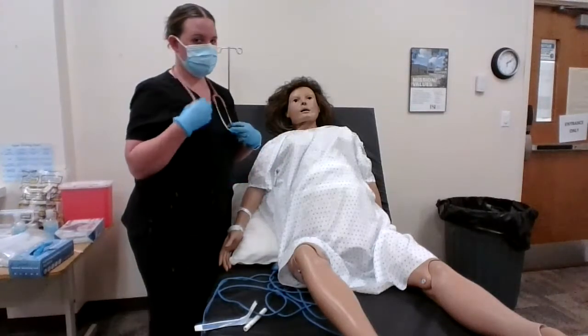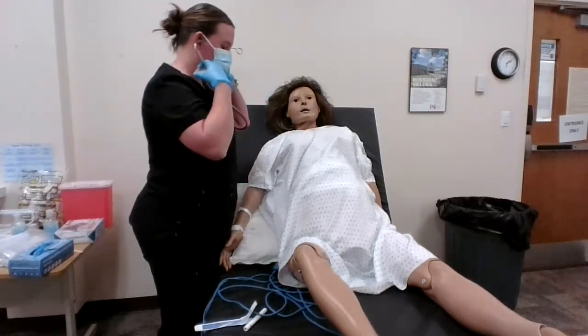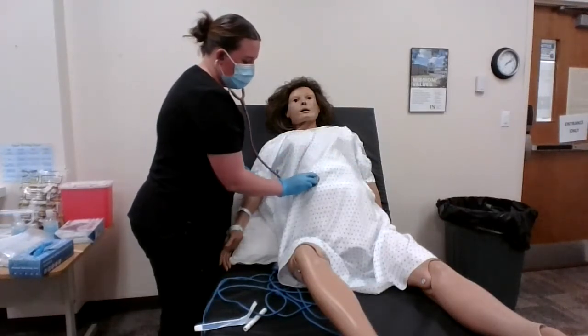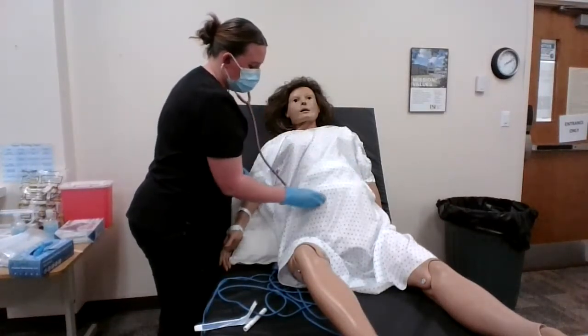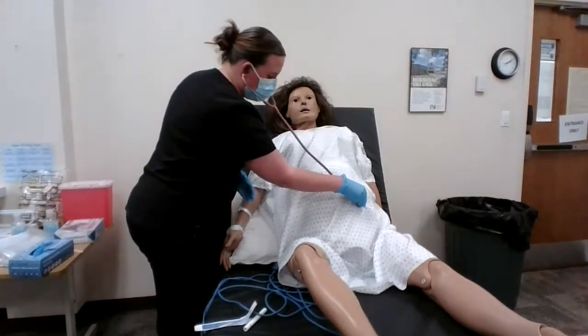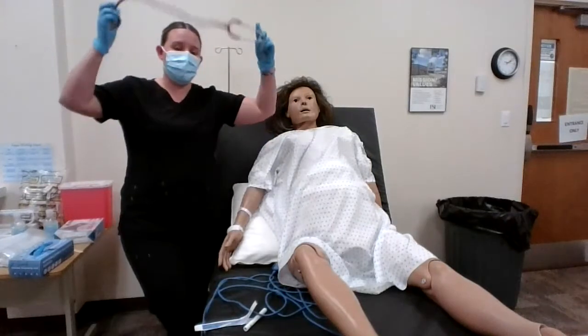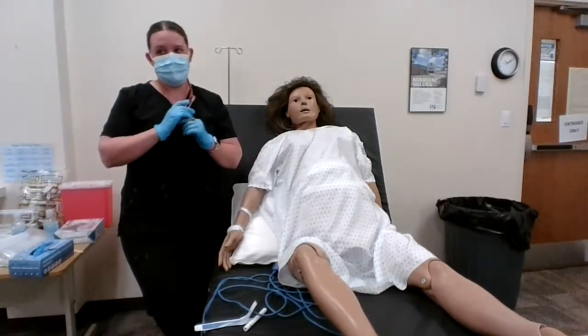Auscultate all 4 quadrants of the abdomen. So there we go. 1, 2, 3, 4. And you are listening to see if the bowel sounds are regular, hypoactive, hyperactive, or absent.